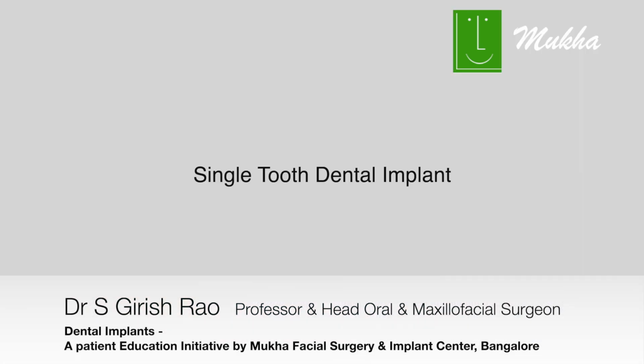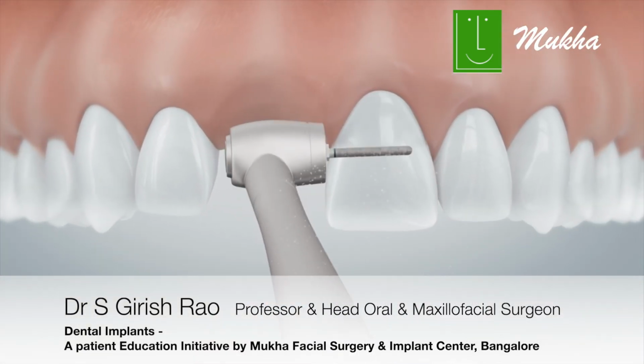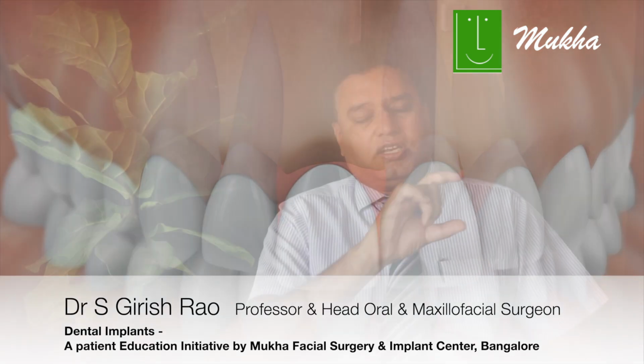Dental implants for single missing tooth. When you have a single tooth which is missing, traditionally we were carrying out what are called bridges, where two neighboring teeth used to be filed, and to that we used to fix crowns which would have basically a tooth attached, and that is what was called a bridge. In this, unnecessarily the two neighboring teeth had to be cut and filed across.